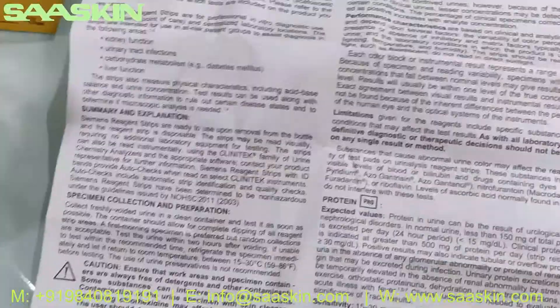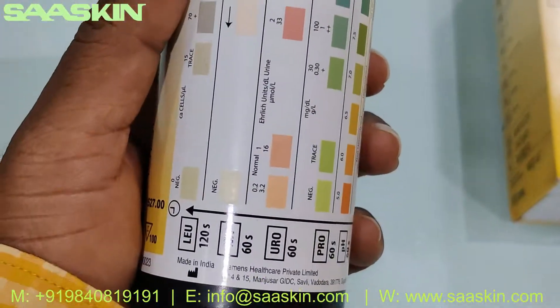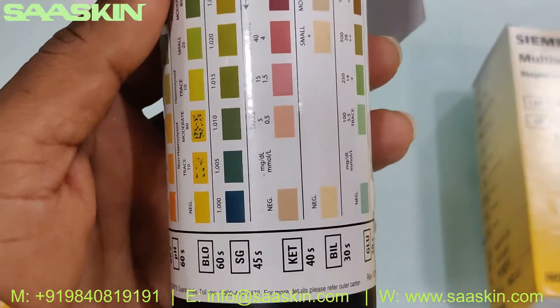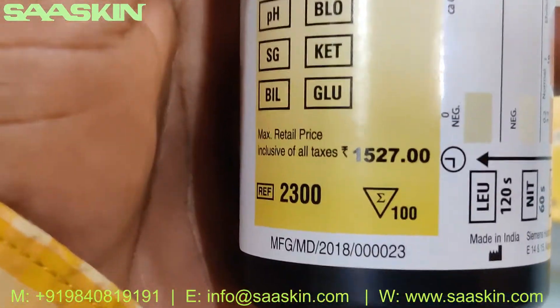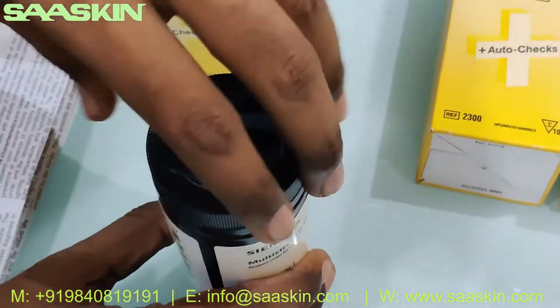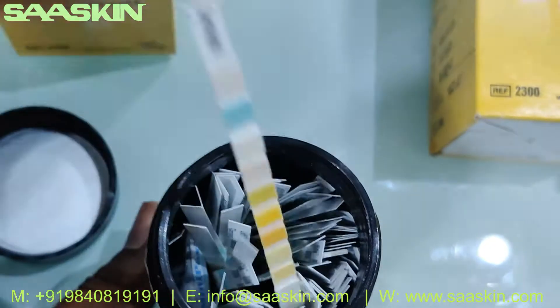Also, just roll this and put it back in the same portion. You can see this is how the test strip box looks like — you can see the different color codes for different parameters. The outside box looks like this. This typical pack contains 100 strips. I'm going to open this for you. You can see this box contains the strips inside.